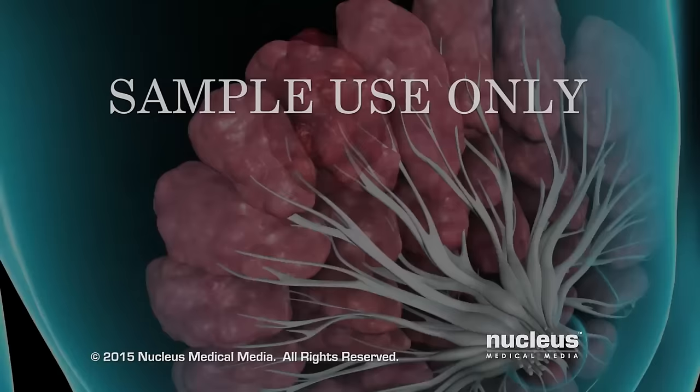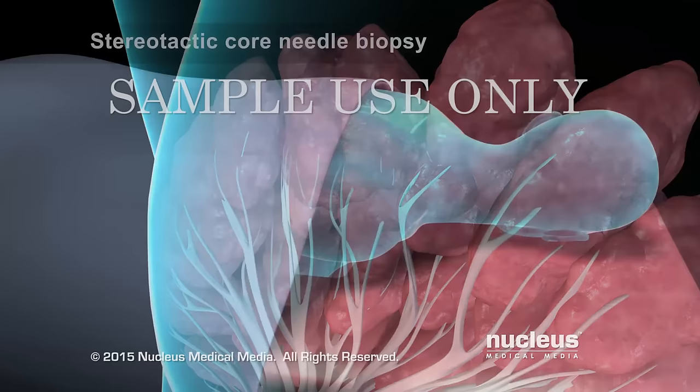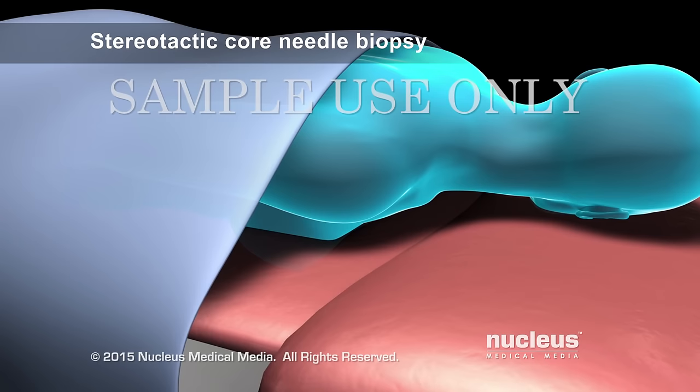A core needle biopsy is done to remove several small pieces of tissue, or cores of tissue, from the breast. It may be guided using one of several techniques. During a stereotactic core needle biopsy, you will lie face down on a table with your breast inserted through a hole in the table.